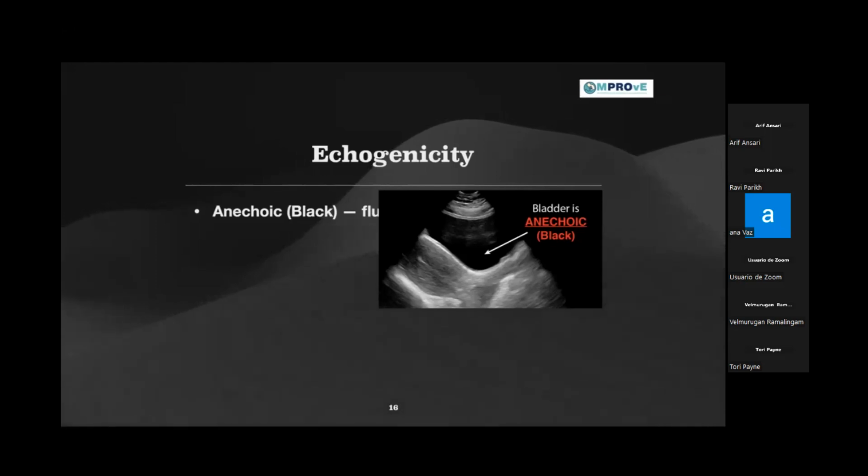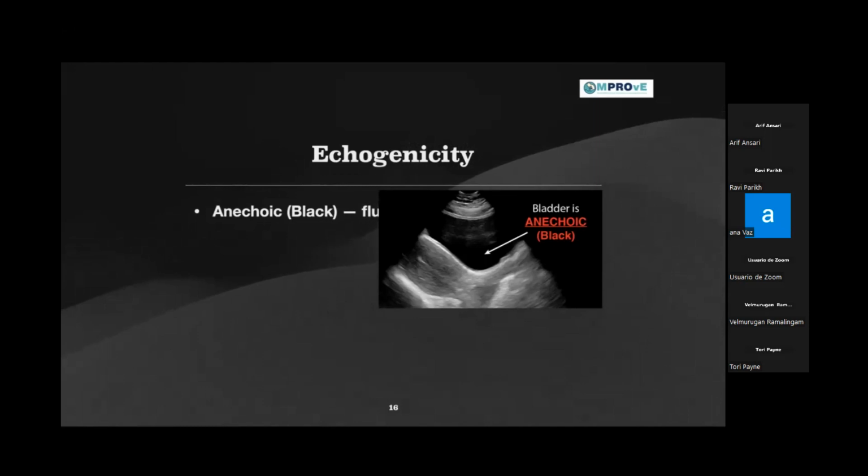And how do we do that nowadays? To cut down on the attenuation and the reflection of the waves from the air, which is not a good medium for ultrasound waves and reflects all of them, we use this gel to limit the gap between the transducer and the skin. It removes the air barrier, basically, to help propagate the ultrasound waves.